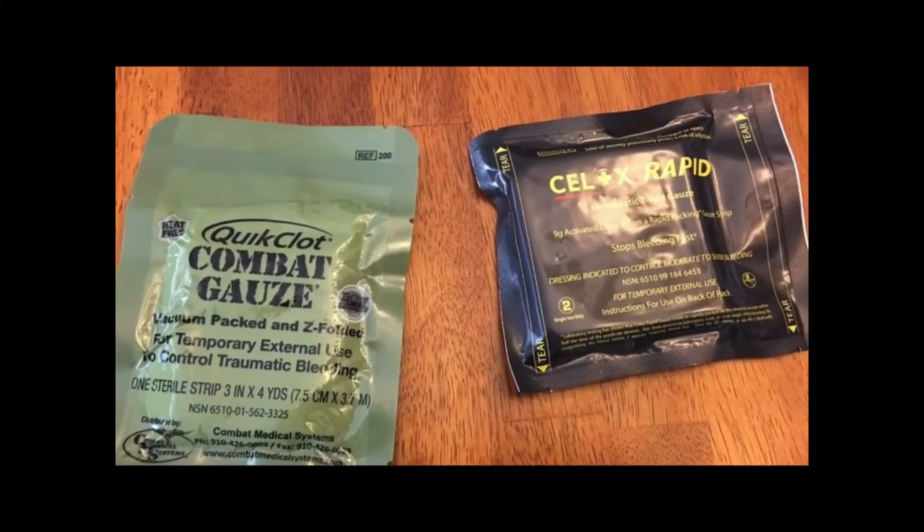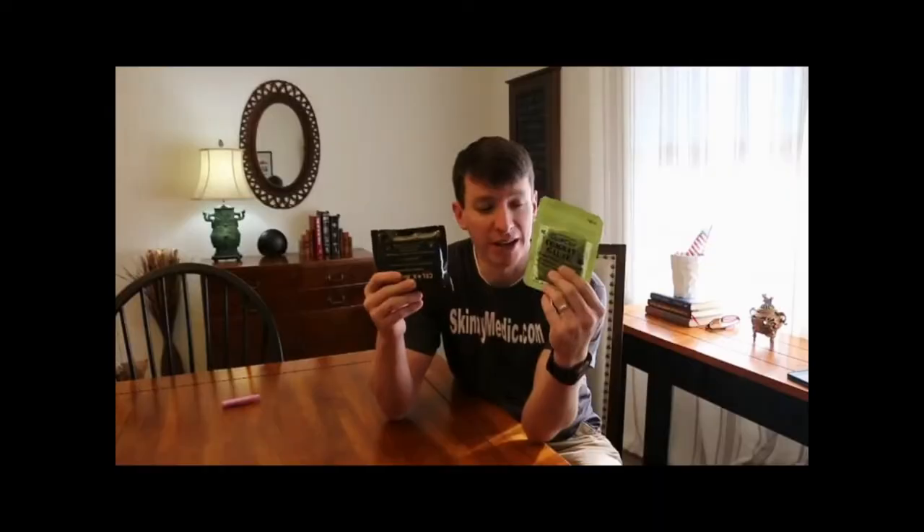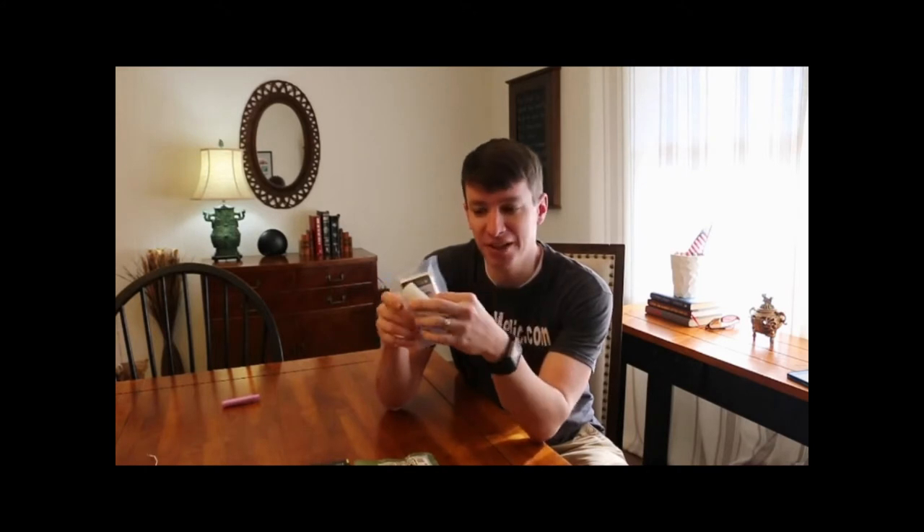If we talk about what is the best product that you can buy to save your life, to save your friend's life, then let's talk about hemostatic agents. This is the gold standard. This is what people are using for wound packing. This is combat gauze. These things are expensive — you're talking about $45 to $55 for brand new combat gauze. So that's our hemostatic agent.